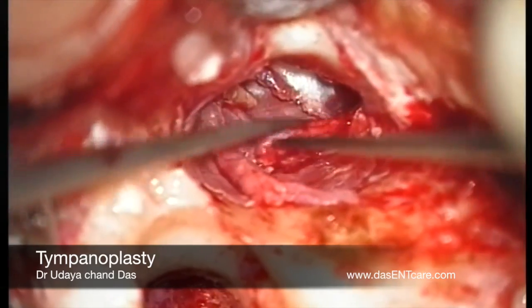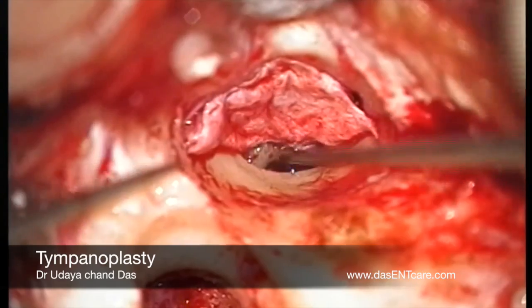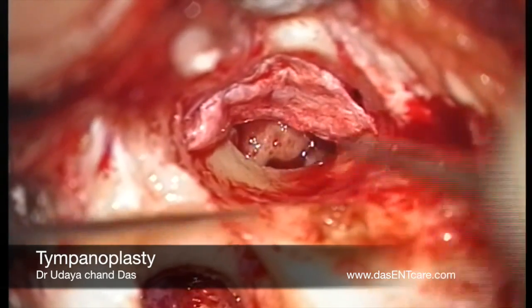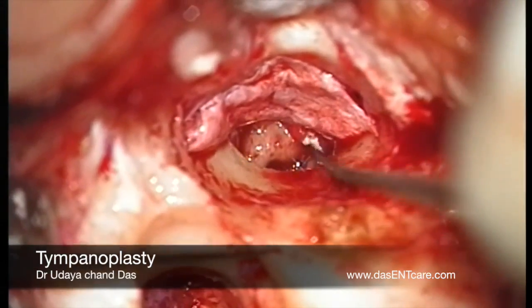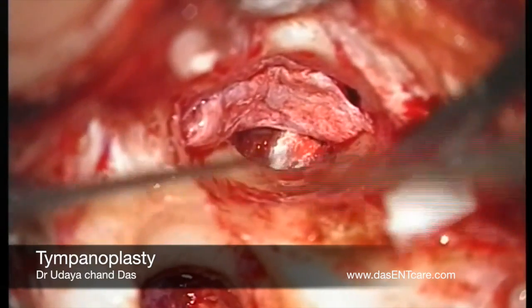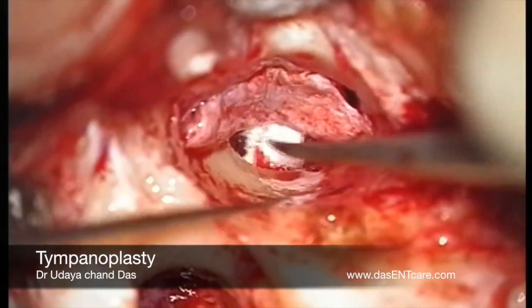The tympanomeatal flap is deposited onto the graft, and then I usually lift the tympanomeatal flap back and insert gel foam soaked in antibiotic solution into the middle ear. This ensures a complete sandwich of the graft between the gel foam inside and the gel foam which will be placed in the external auditory canal, thereby further reducing the chances of graft lateralization.